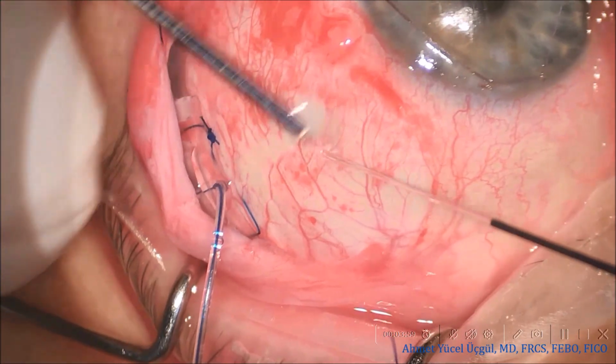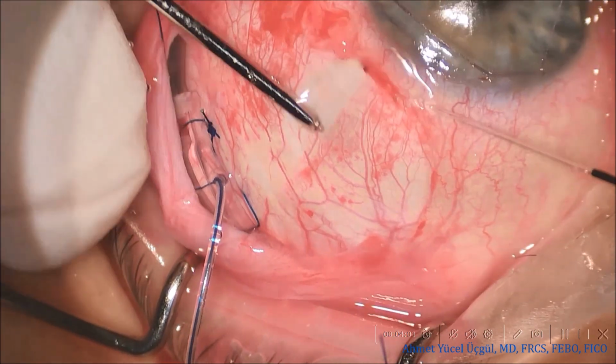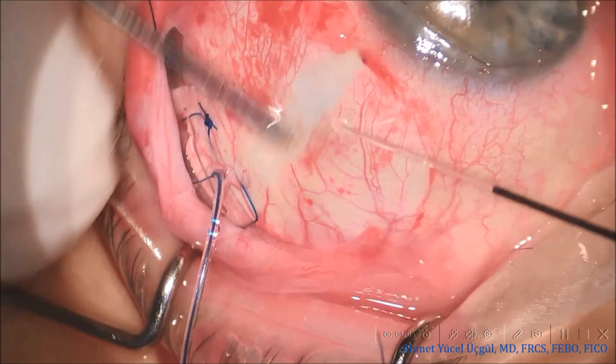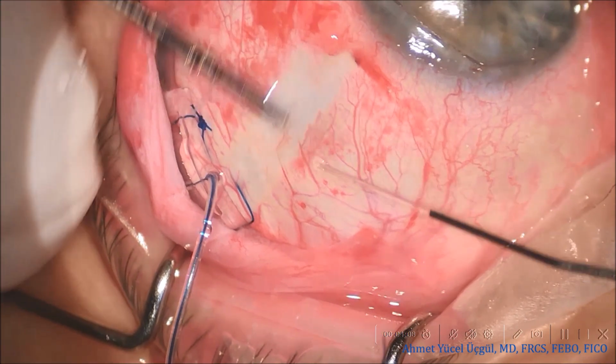At this stage, I apply cautery with the lowest effective energy while maintaining continuous irrigation. My goal is to obtain adequate hemostasis while avoiding unnecessary thermal injury to the sclera and surrounding tissues.